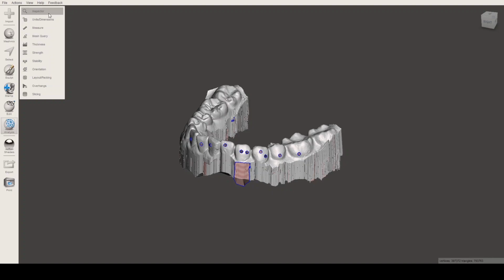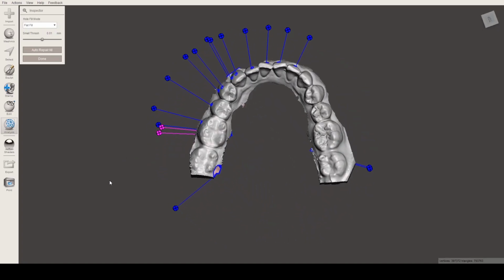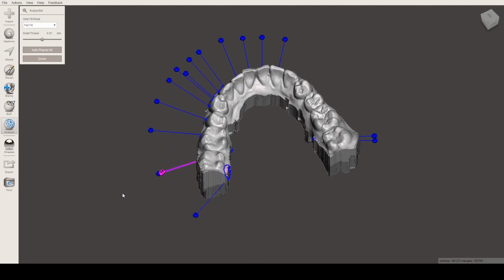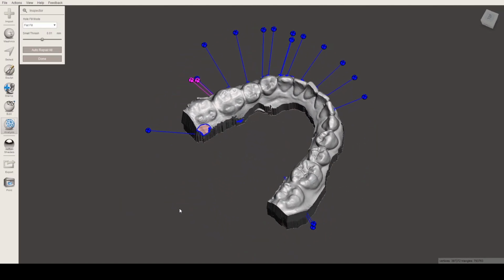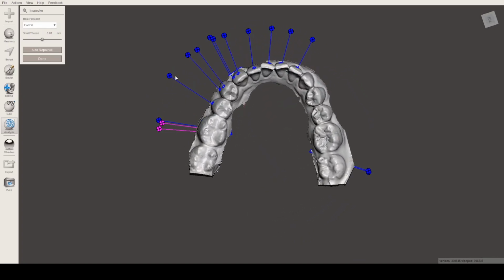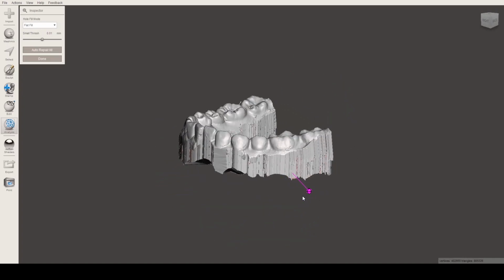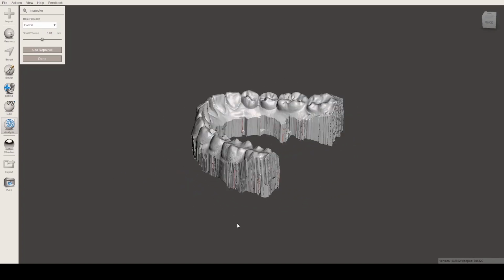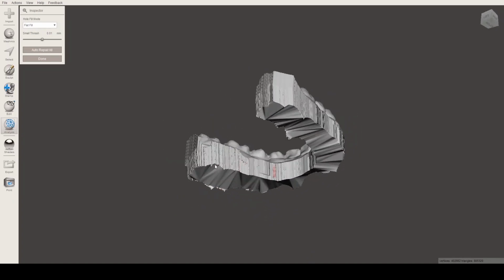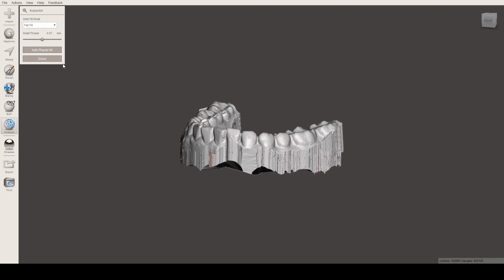When you click analysis, I'm not gonna go through the other parts. We're just gonna click analysis and then click inspector. Now once inspector is clicked, it will show us blue balls, and you can click those balls and you will see what it does. Let me just demonstrate how it's done. You just click it and it will fill the hole automatically for you, which is really convenient. So just click those balls. It lagged again, sorry about that. Click those balls, click those balls. Just finish clicking those balls, and what we have here is a perfect model. So basically that's a printable model now.